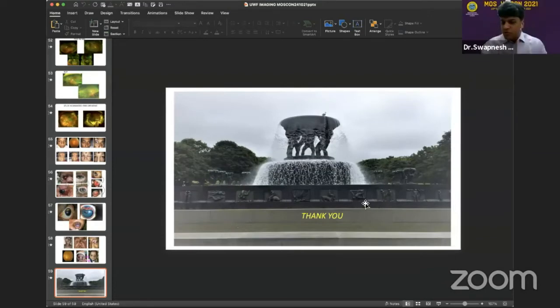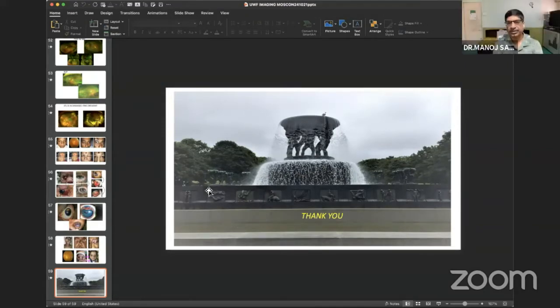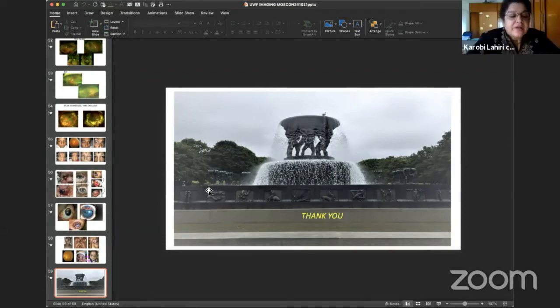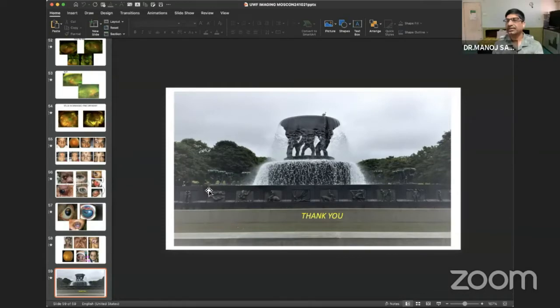Thank you very much for showing us an atlas of all the various retinal diseases. Just one question, sir, which is the device that you are using? I'm using this Optos Daytona, which is giving ultrawide fundus photography as well as fundus autofluorescence of almost 200 degrees. Daytona is much smaller than the earlier Optos wide field imaging machine, right? Yes, it is very useful and handy, and you can screen almost every patient. Otherwise, the Optos has angiography as well as ICG facility. This facility is not with the Daytona.